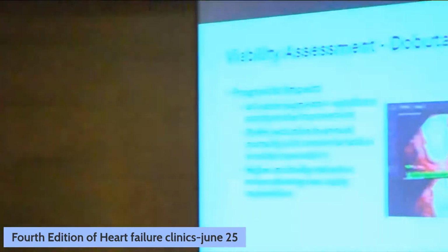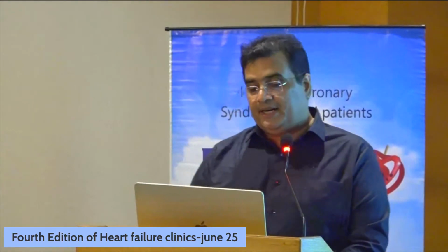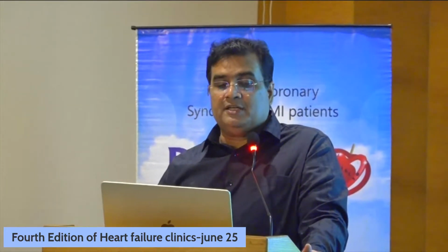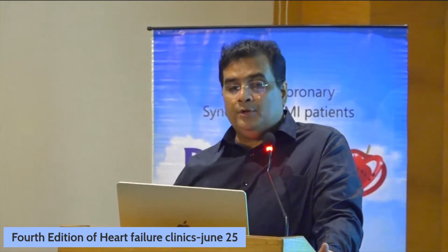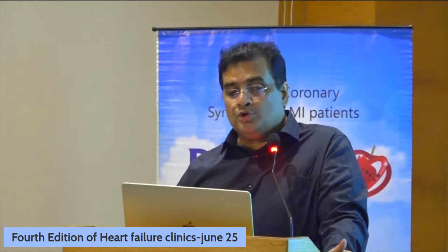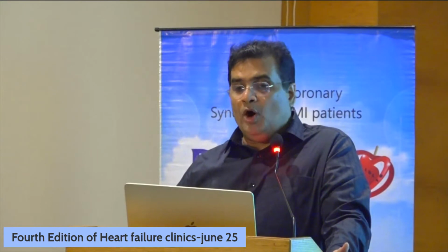Now, the same thing we can see in a two-chamber view also, the contrast echo. If there is an improvement of at least 4 or more segments, you can say that if you do a bypass surgery, this patient is going to get better. Why is it important? Many times we are now getting patients who have significant left ventricular dysfunction and much coronary artery disease. We do a bypass surgery, is the patient going to get better or not? This is a very crucial decision for us. If we are not able to understand that, by doing a surgery you are putting the patient to huge risk. So to avoid that risk, we need to treat these patients in a much better way.